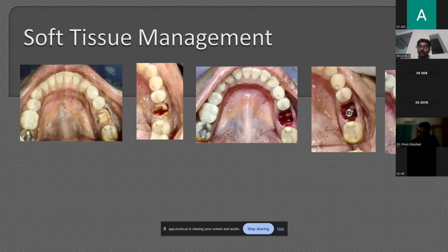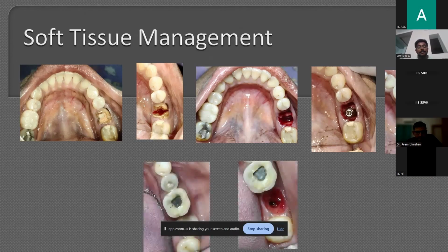raising a flap, we can do a customized abutment where we can add some sterile Teflon into the extraction sockets, and use composite to build over it. Then once we remove the customized healing abutment, we can polish it nicely and put it back onto the socket. This will help us to seal the socket perfectly. And this is the kind of result that we will get after 3 months when we remove the customized abutment. This provides a wonderful bed of soft tissue cuff that has been formed.